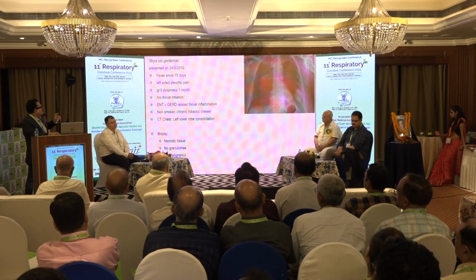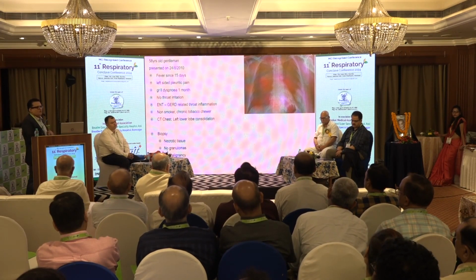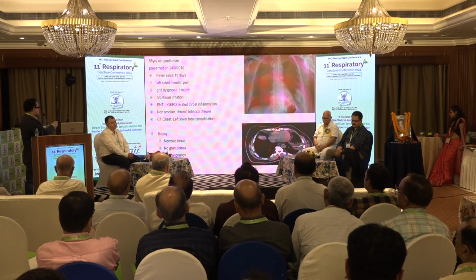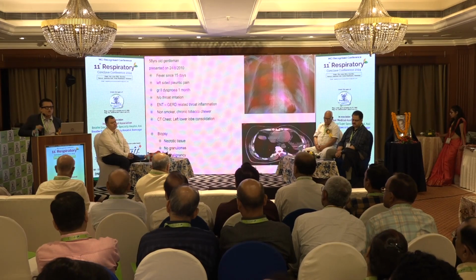We did this case, and in this patient, clearly you see here, there's a left lower lobe patch on the X-ray, left lower zone. For this particular case, as was shown earlier, CT guided biopsy was described. So we did a CT guided biopsy, and it showed necrotic tissue, no granulomas. Basically, it is non-diagnostic. It's typically very surprising, but if you have a proximal obstruction, then the distal lung biopsy may be inconclusive.